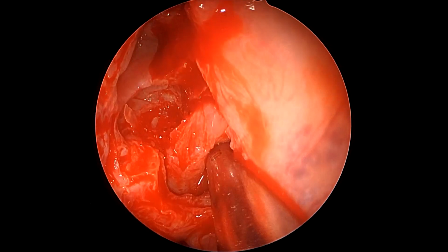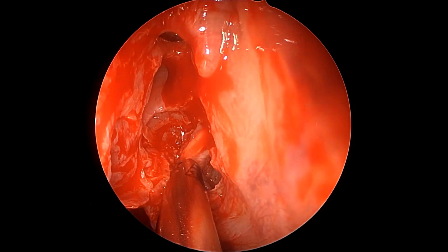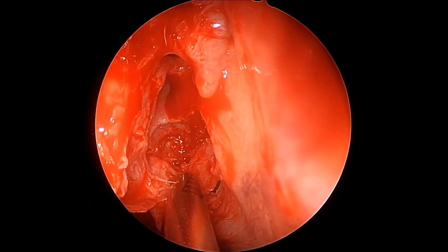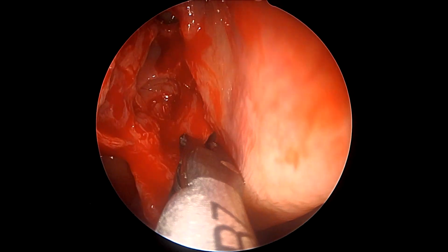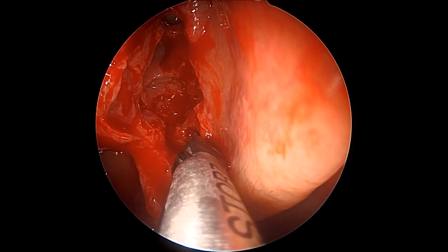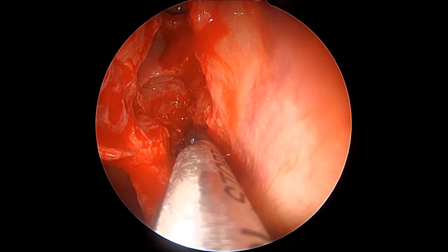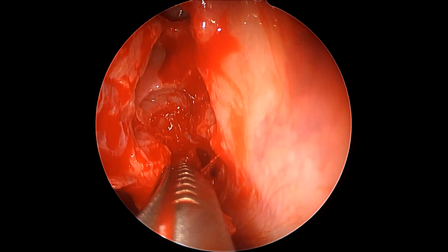We might leave the superior portion of it because that can carry the olfactory sensation, but the inferior half or inferior two-thirds of the superior turbinate can be safely removed, either using a microdebrider blade or a sharp true-cutting forceps, to give us a clear vision into the sphenoid recess and the sphenoid sinus.